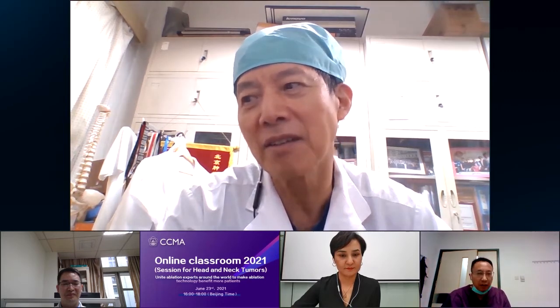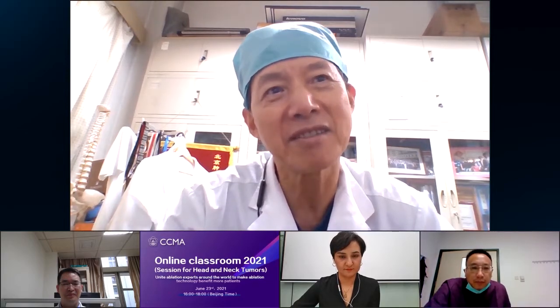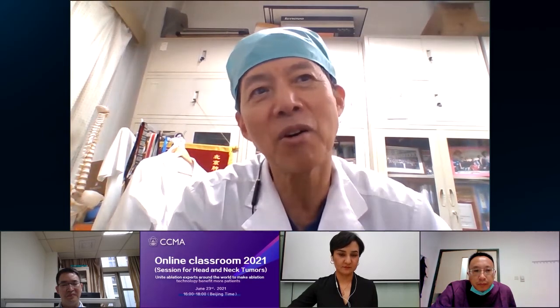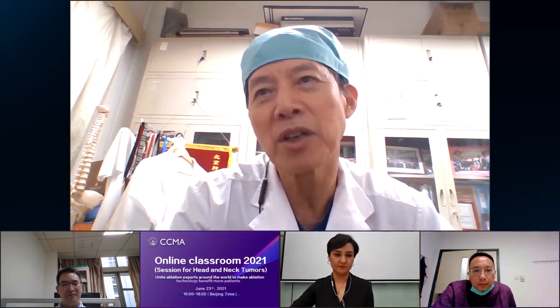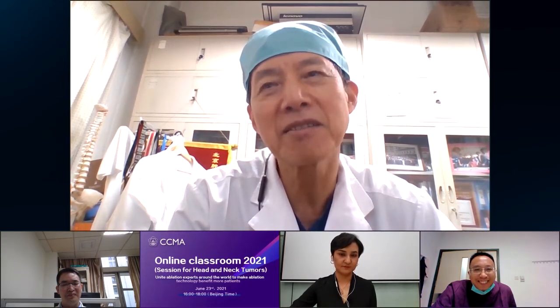Just now, Dr. Long spoke about the ablation complications. Sometimes the doctor thinks we should do more and do a complete ablation, but the result is not so good because of complications: injury of the tissues, injury of the organs, and adhesion of the tissues. So we should pay attention to these complications.